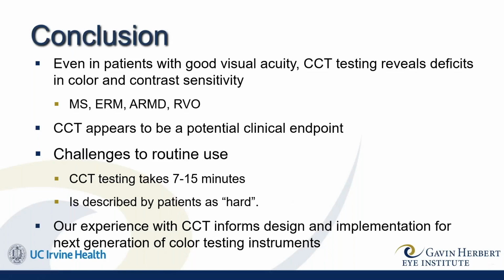I don't have it performed on every single patient, but if there are patients that have 20/20 vision, but I suspect that they don't have a good 20/20 vision, then I do obtain the test so I can help to educate the patient and show them that they truly do have a reduction in their visual function and that they should optimize their living environment at home with good lights and reduced fall risks.